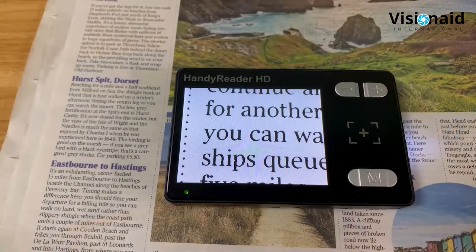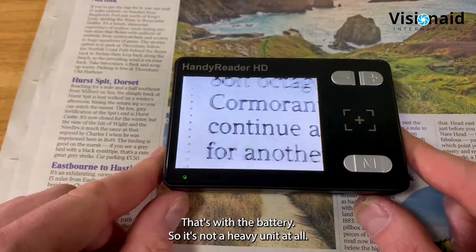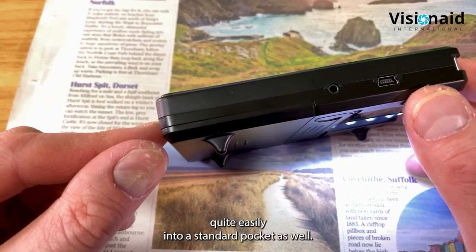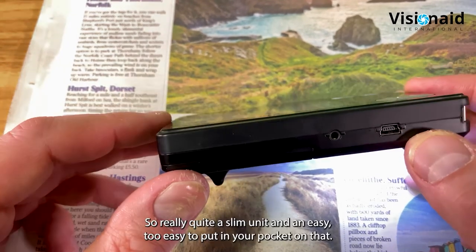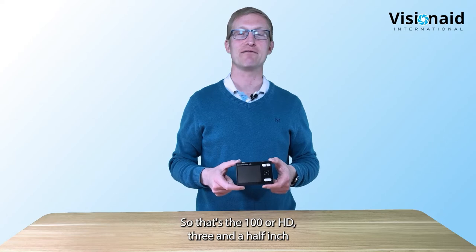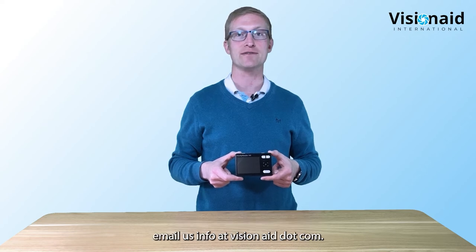The Handy Reader HD weighs only 150 grams or 5.3 ounces including the battery - not heavy at all. Dimensions are 11.5 by 7.5 by 2.7 centimeters (4.5 by 2.9 by 1.1 inches), so it fits easily into a standard pocket. That's the Handy Reader HD three and a half inch handheld video magnifier with 60 frames per second camera. For more information, visit visionaid.com or email info@visionaid.com.